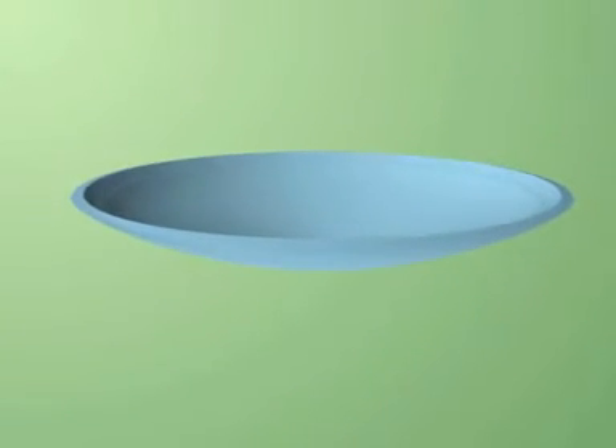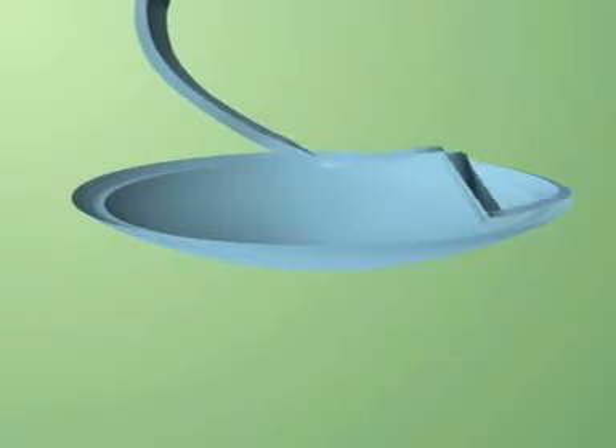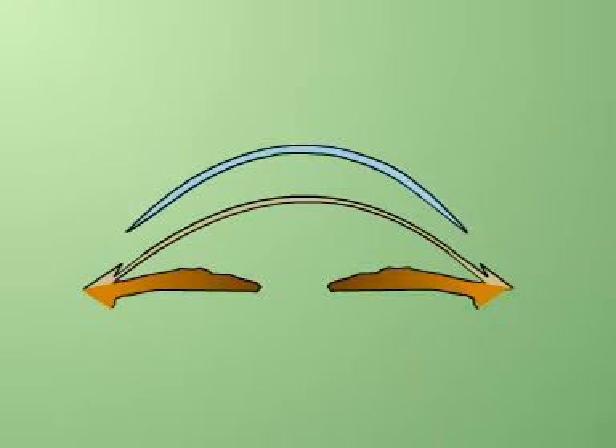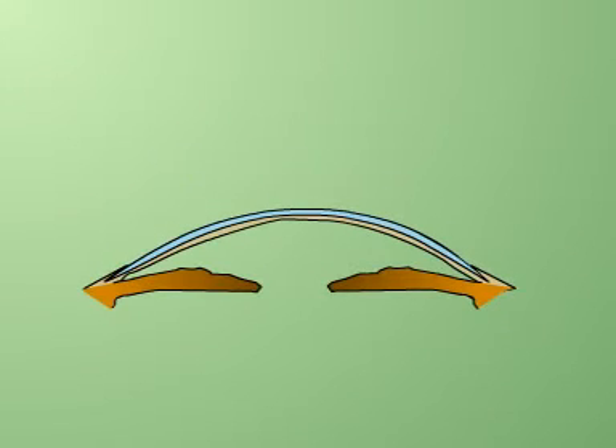A full thickness graft is punched and the endothelium is scraped off. Using fine curved vannas scissors, a bevel or flange of approximately two millimetres is created in the periphery to complement the pocket created in the host. The button is placed over the host bed, and the flange of the graft is tucked into the peripheral pocket of the host created previously, and the graft is sutured tightly.